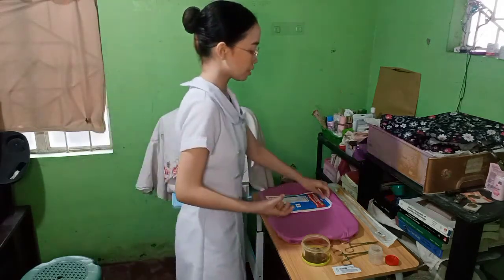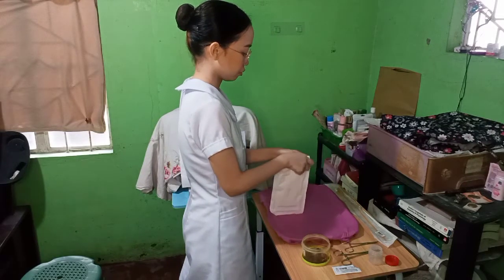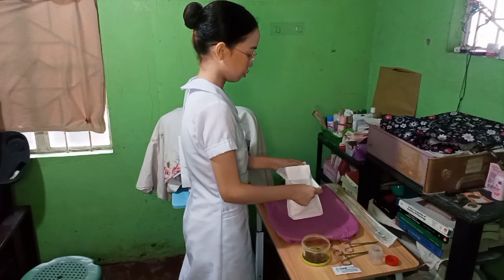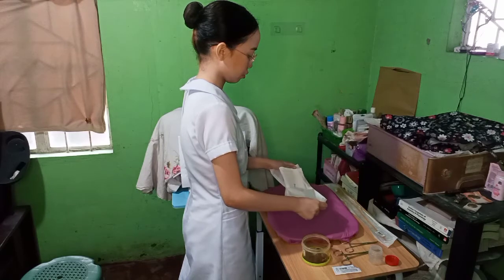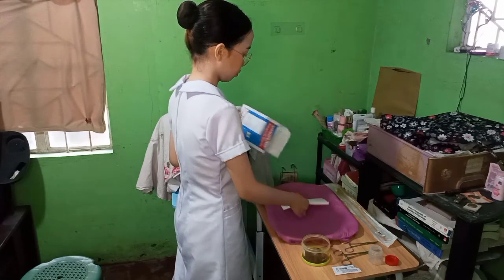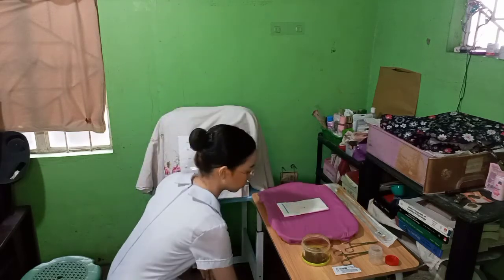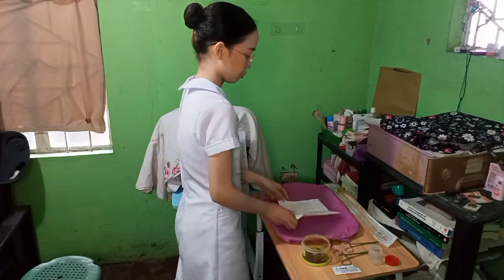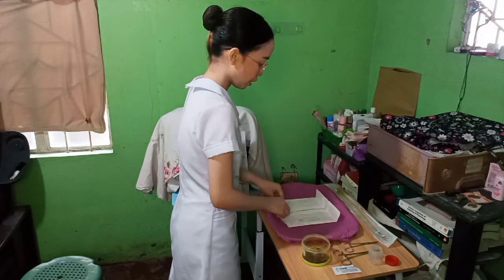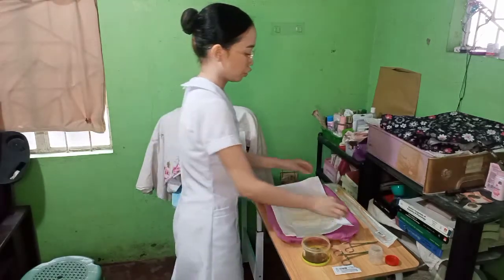So first, open the sterile gloves and make a sterile field. Ensure sterile technique while opening the sterile gloves to prevent it from contamination.